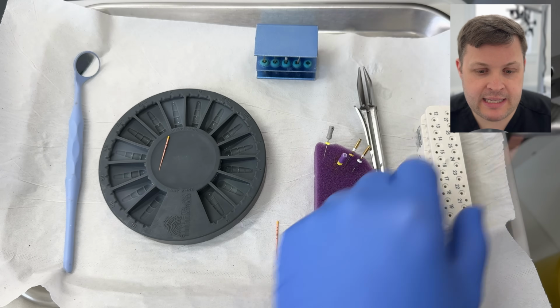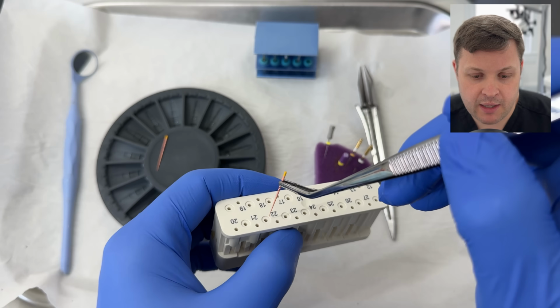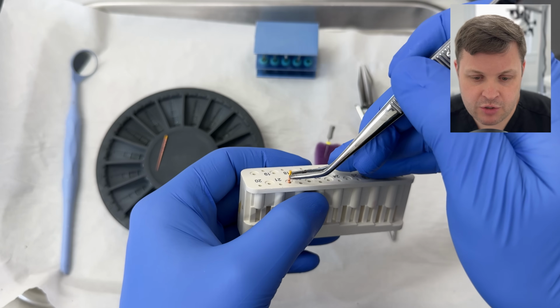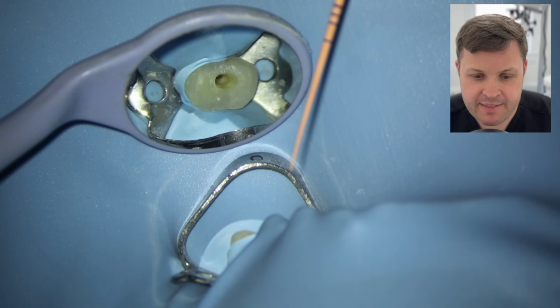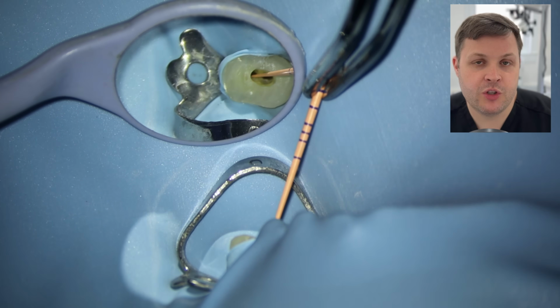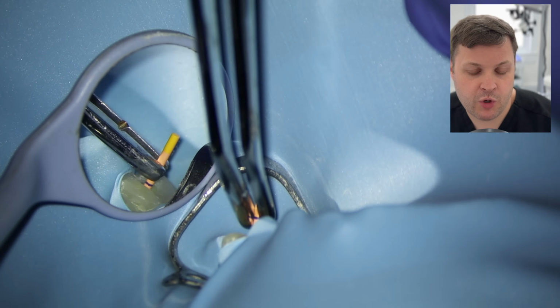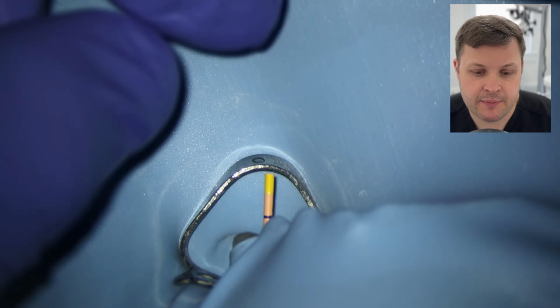We're then going to place the buccal cone at 21.5 millimeters. So I'm just going to use this measuring block here just to work out where the measurement should be. And then I place this GP cone really, really gently to length. And then once we've felt for that snugness and we've checked that the working length is correct, we're then just going to snip the excess off right at the end.